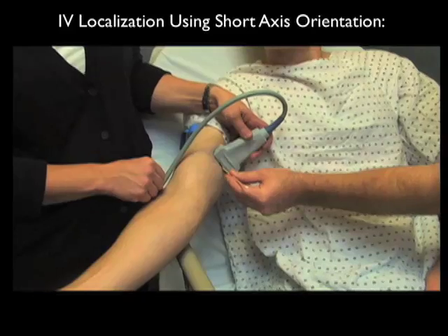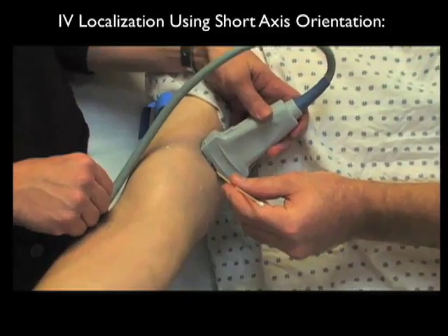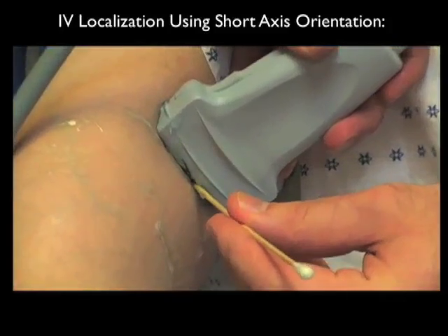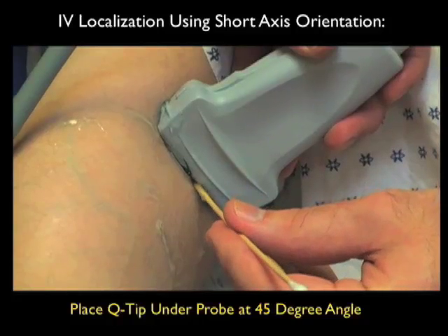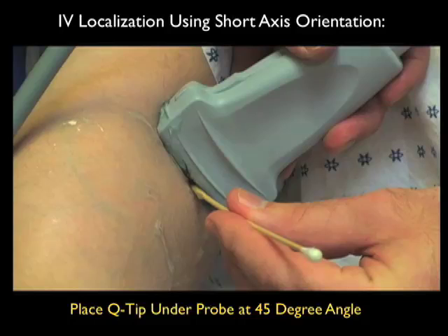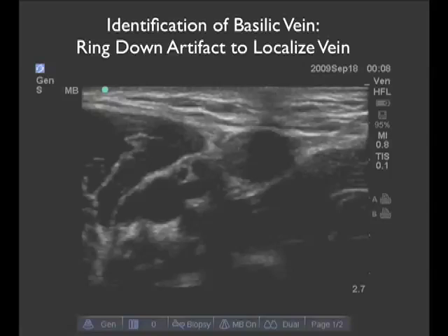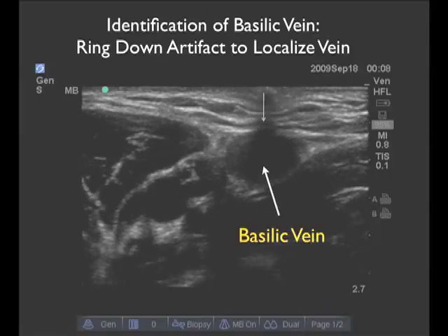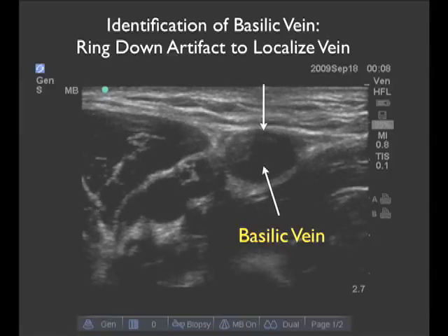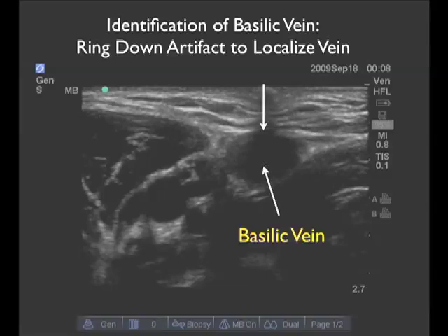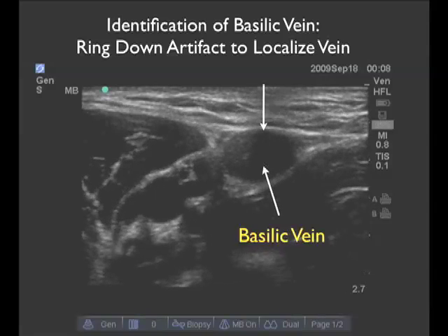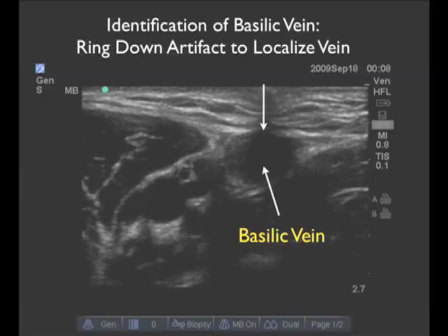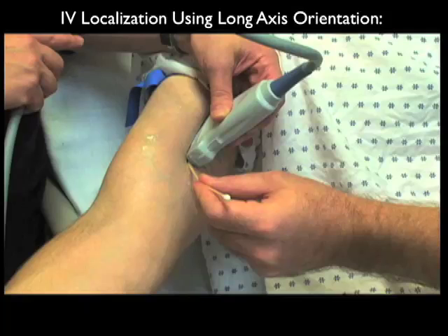Once we've selected a favorable target vessel for cannulation, we can place the probe in a short axis or side-to-side orientation. Here we're using a Q-tip coming in underneath the probe at a 45-degree angle to look for the ring-down artifact for guidance for placement of the IV in a side-to-side or lateral orientation on the patient's arm. We can look for a finding known as the ring-down artifact on the ultrasound screen. Notice we have a nice plump basilic vein in the middle of the field, and we can see a dark mark emanating from the surface directly down, which is the ring-down artifact caused by pressure from the Q-tip. This would be the appropriate poke point for placement of the IV.